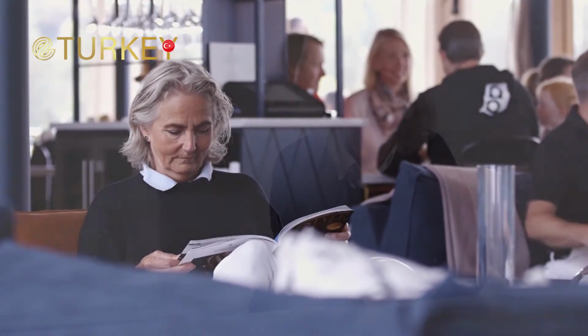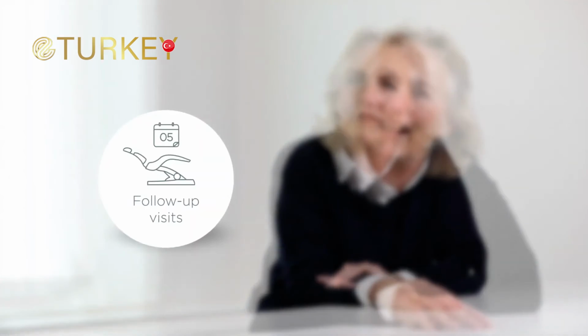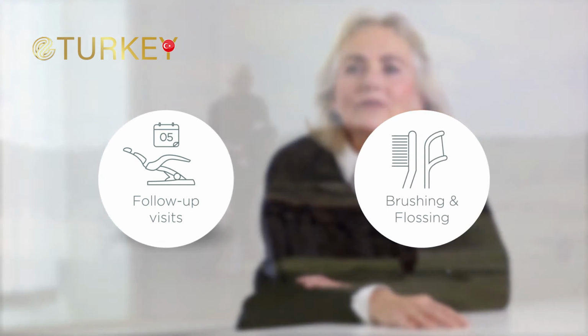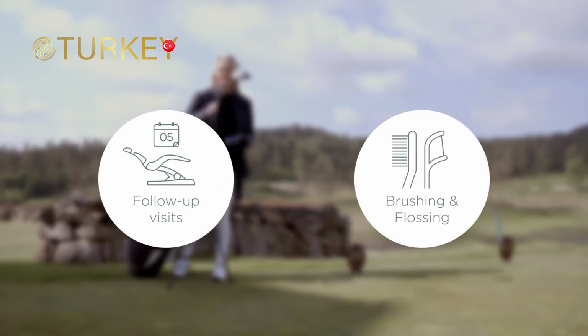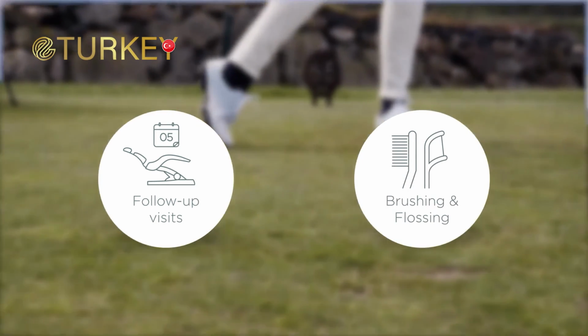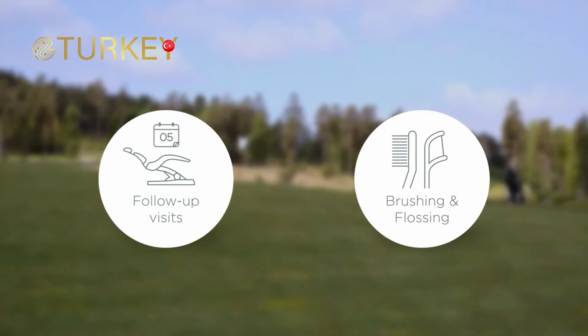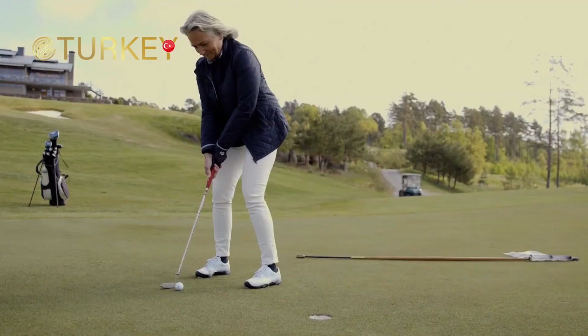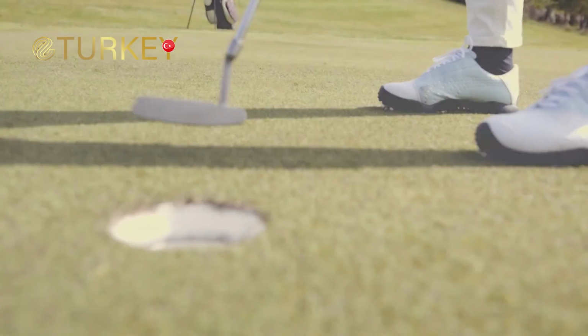Over time, make sure to attend your routine follow-up visits and take care of your implant-supported teeth by brushing and flossing as you would your natural teeth, and carefully follow the instructions provided by your dental professional. The more well cared for an implant is, the longer it will last. A well-maintained implant can last for life.